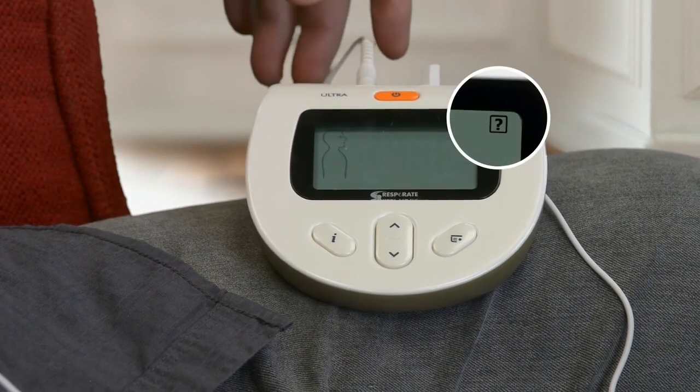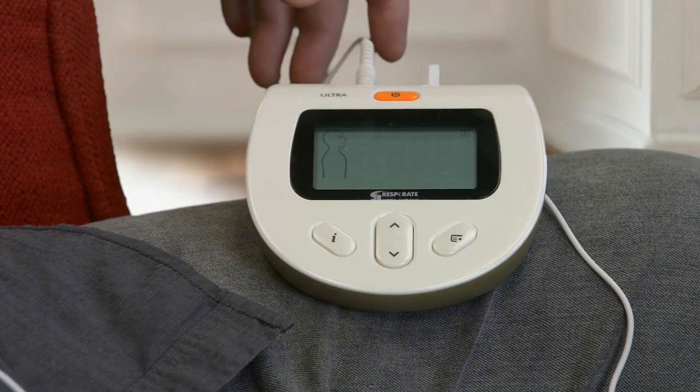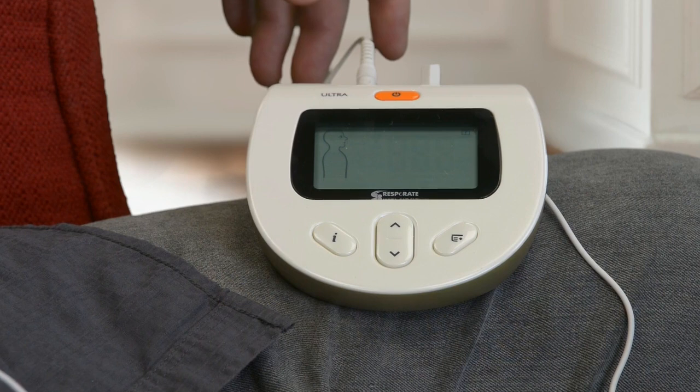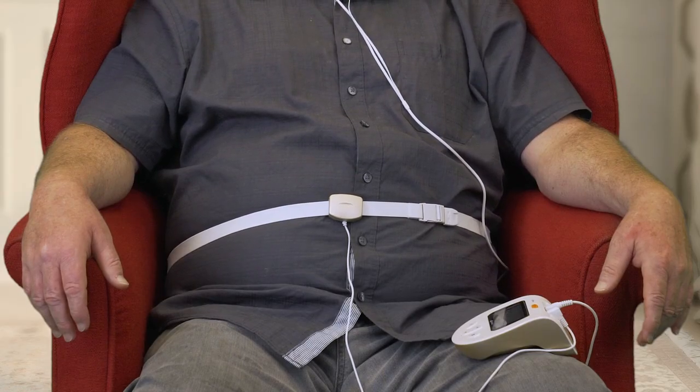Welcome to the RESPeRATE tutorial. RESPeRATE lowers blood pressure by guiding you into therapeutic breathing, slow, effortless breathing with prolonged exhalation. In the following minutes, you will go through a step-by-step tutorial for using RESPeRATE. Make sure that the elastic belt is wrapped around your abdomen, with the sensor midway between your navel and chest. The belt should be buckled and adjusted to fit snugly. If you would like to hear this information again, press down now. Otherwise, press up to continue.